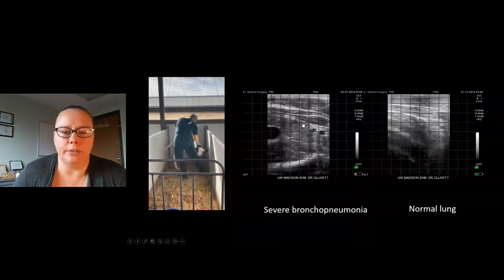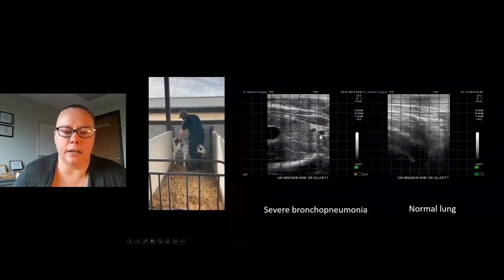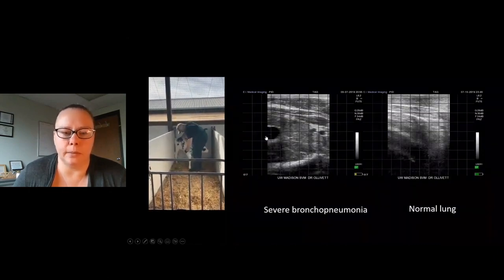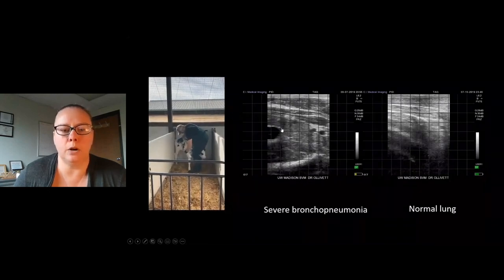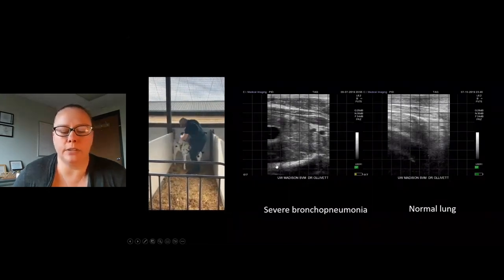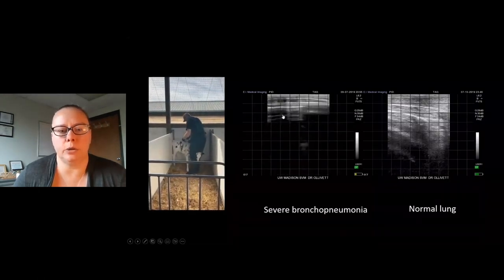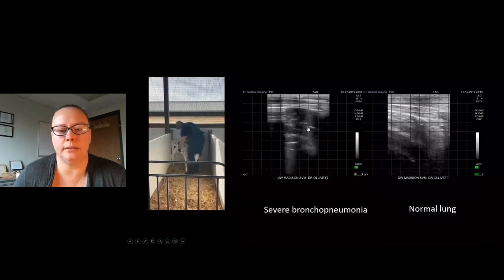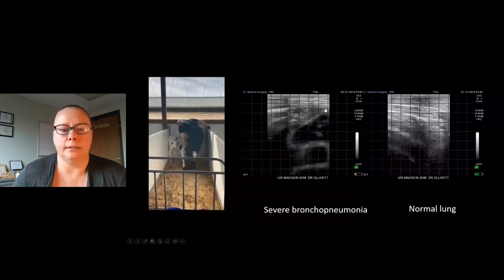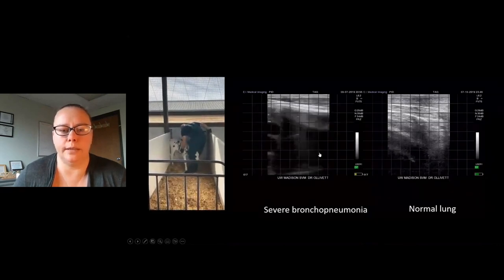In the calf on the left that has bronchopneumonia, or bacterial pneumonia, I now see the architecture of the lung. It's this gray, kind of speckled appearance. I can see a blood vessel in the middle of the lobe that's pulsating when the clip is live. I'll let this go, and you can see here's consolidation. There's some normal lung, here's consolidated lung, normal lung, consolidated lung, normal lung, consolidated lung, and then a big lobe of consolidation.